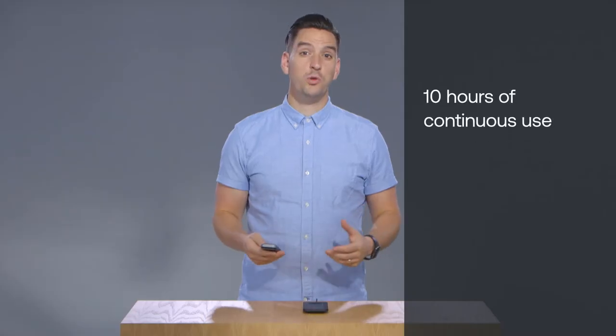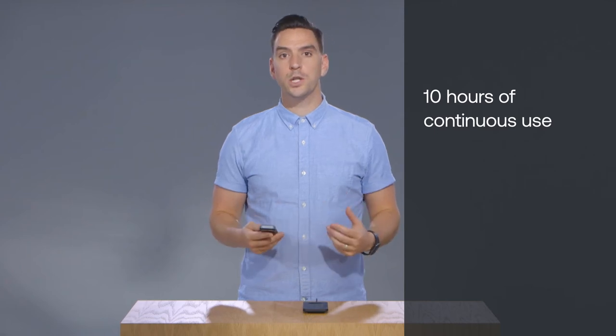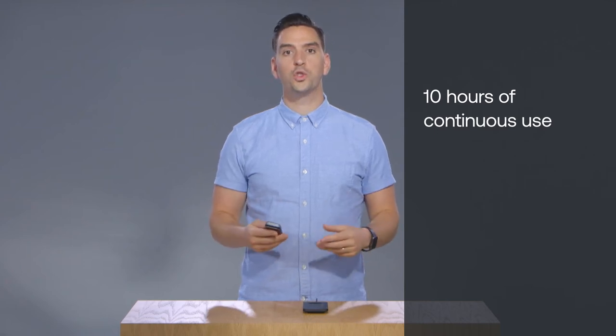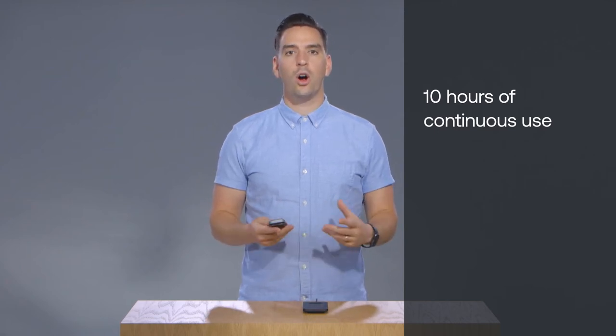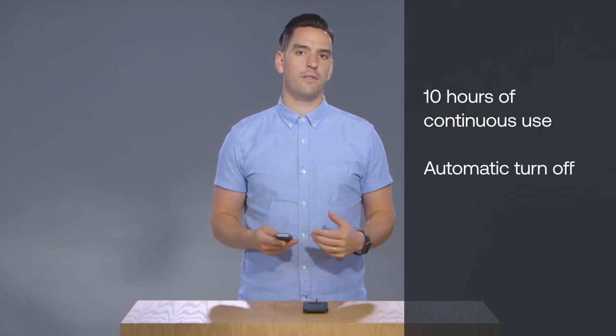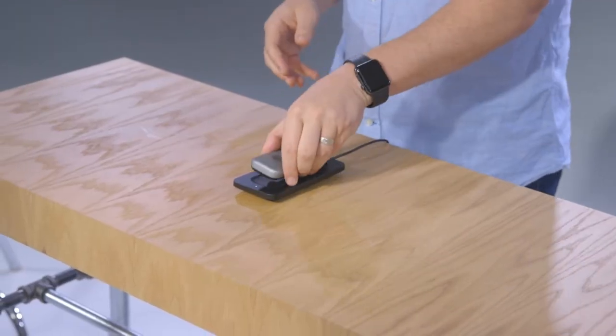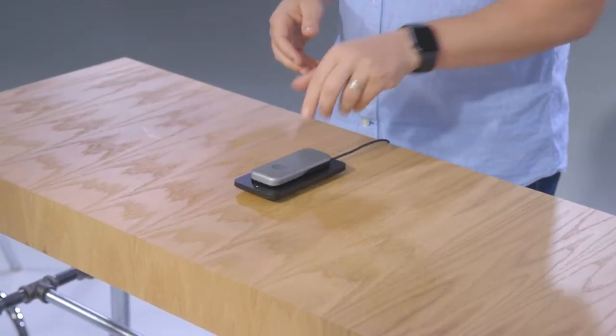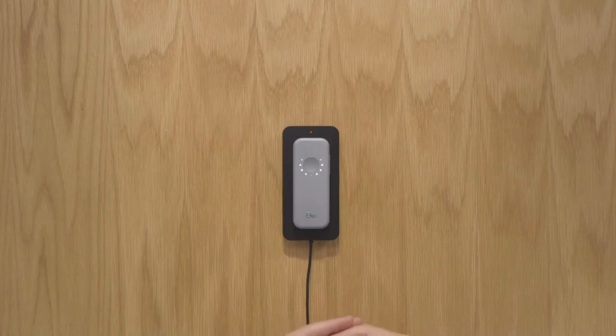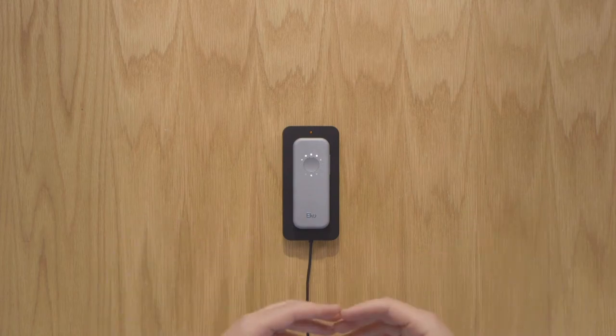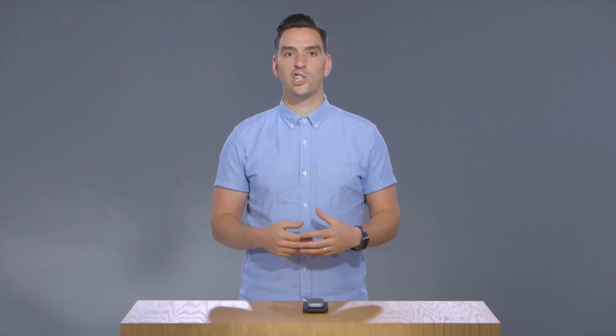The rechargeable battery lasts for 10 hours of continuous use on a full charge and automatically turns off after five minutes of inactivity. To charge, simply connect the USB powered wireless charging pad to the power source and place your Duo onto it. The LED ring will illuminate and an orange light will appear on the charging pad. All lights will turn off when it is fully charged.